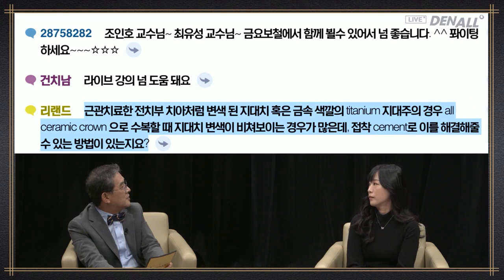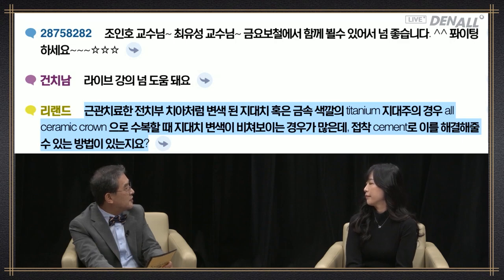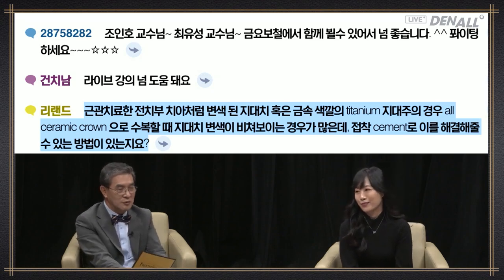Leland. In the case of discolored tooth like that of anterior tooth which has gone through endo treatment or the tooth with titanium abutment, when you restore with all ceramic crown, discoloration of abutment at times shows through. Can we solve this with adhesive cement? This is the question.